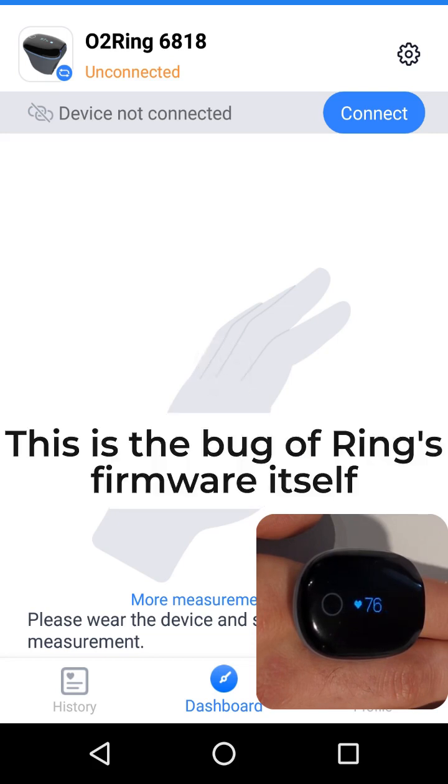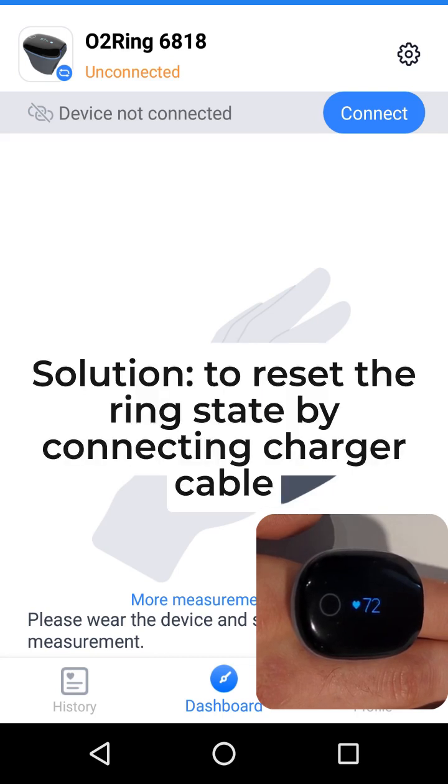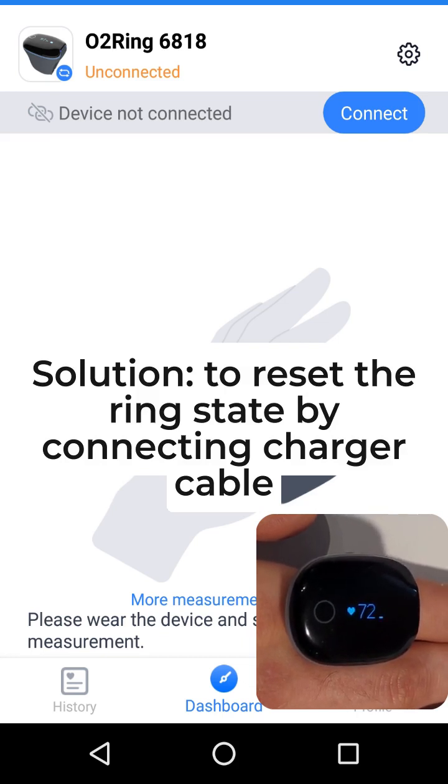This is a bug in the ring's firmware itself. The solution is to reset the ring state by connecting the charger cable.